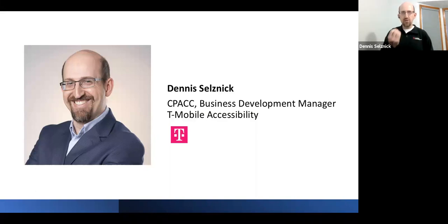Getting a cochlear implant is not a cure. Cochlear implants are a tool, and the results are on a spectrum. You can have near complete hearing restoration to possibly benefiting through maybe sensing environmental and directional cues. There's still that gap, especially in this pandemic where the usual in-person interactions have become very challenging. But there are solutions to help cochlear implant users and other people with hearing loss achieve what's called functional equivalence. And the goal there is to be the equal in capability to someone who does not depend on assistive technology.